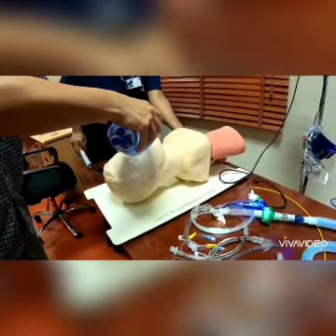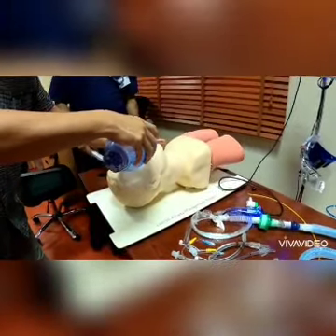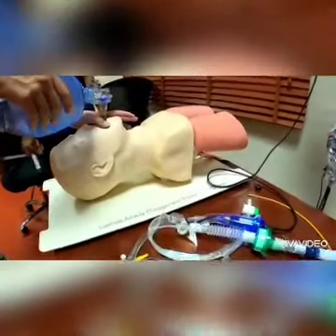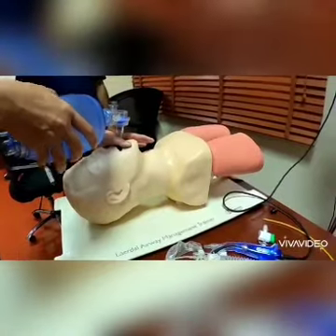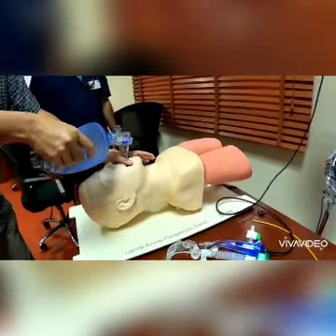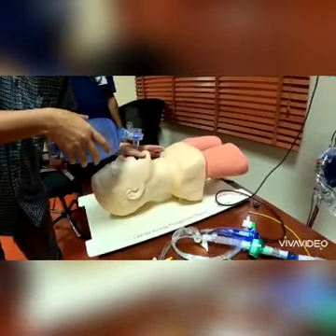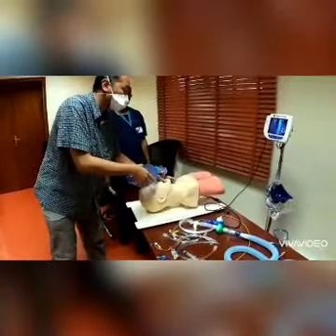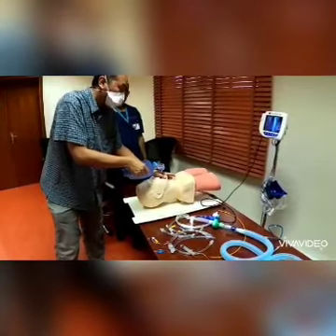When you ventilate the patient, you need to do two things. You need to sense with your left hand that there is not so much leak at the mouth. And the second one, the more important one, you need to see that the chest is rising. By this stage, it'd probably be too risky to just wait for the saturation to come up, because most of the time the saturation is very low, and there's always going to be a lag in saturation. Maybe it'll go up after 1 minute. If you're confident the chest is rising, then you can continue to bag the patient.